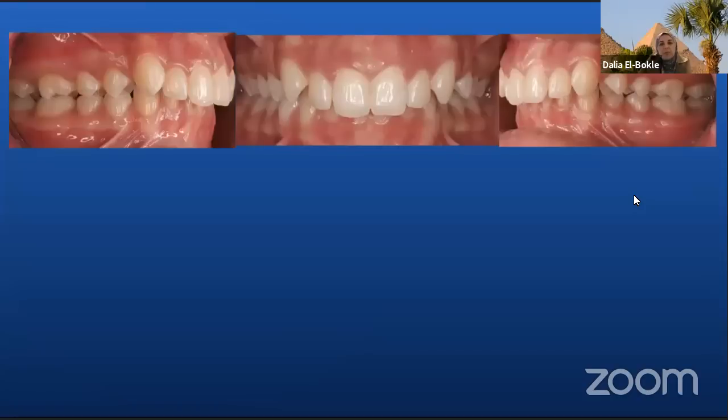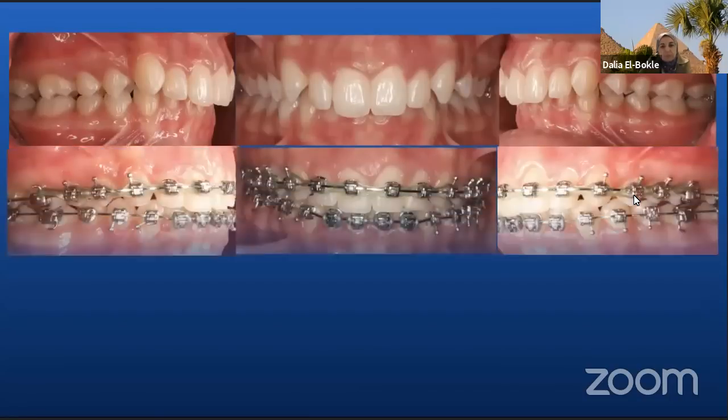The anterior bite turbo in her case allowed for the deep bite correction as well as for the overjet reduction with the class 2 elastics. So here is the center of resistance, the red dot representing the center of resistance of the upper arch, and how there will be a moment on the upper arch which will help with the correction of the deep bite.